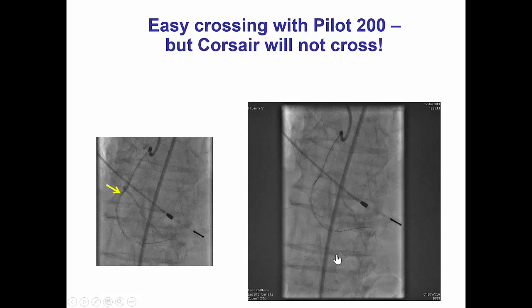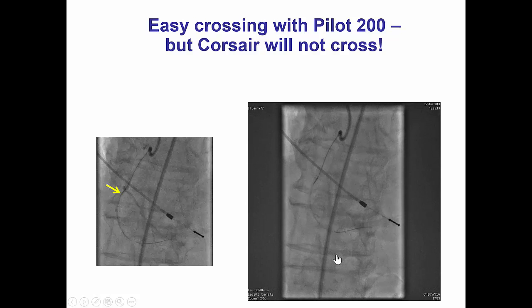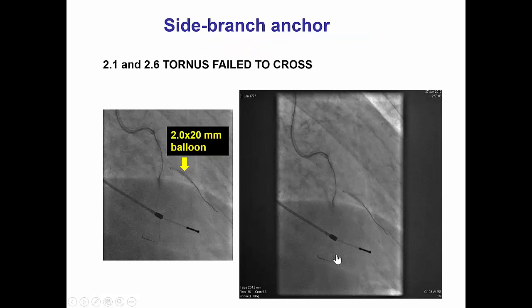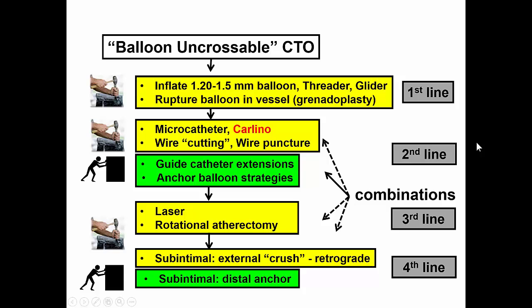As we expected, the lesion was very easily crossed with the Pilot 200. However, we could not cross with the Corsair microcatheter or any other small balloon. We tried the Tornus, both the 2.1 and the 2.6, but were also unsuccessful. There was a large marginal branch on which we advanced a balloon doing a side branch anchoring balloon, but still could not advance the microcatheter or balloon past the mid part of the right coronary artery.